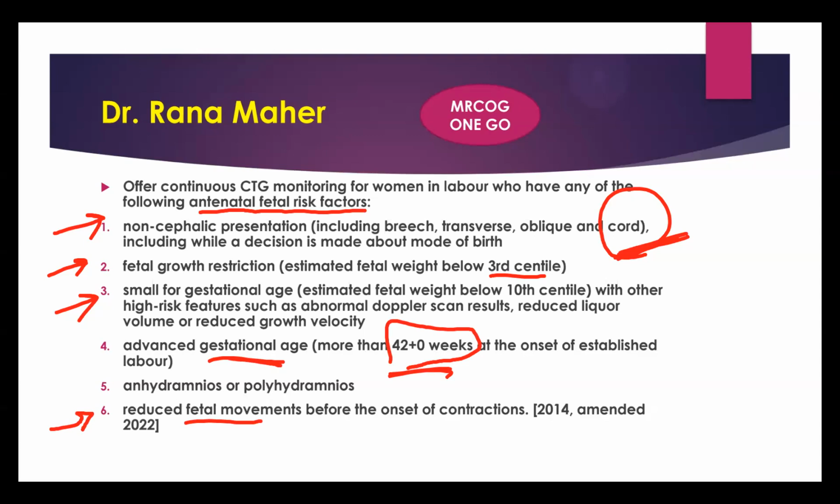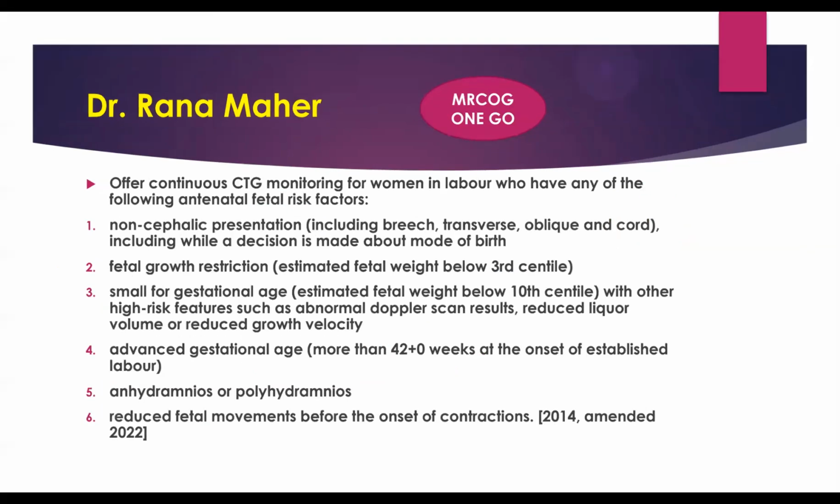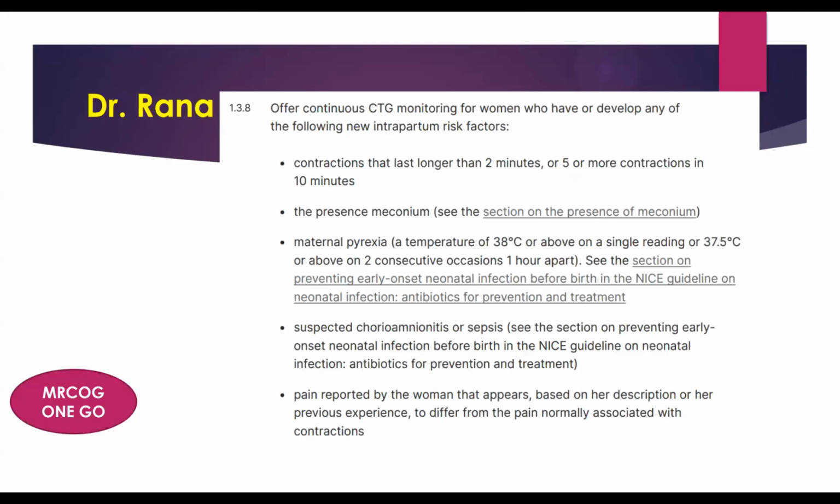For the fetal risk, what about the indications here? Non-cephalic presentation, fetal growth retardation, small for gestational age, prolonged pregnancy more than 42 weeks, and any problem in the amniotic fluid, polyhydramnios, anhydramnios, oligohydramnios, and reduced fetal movement, but it has to be before the onset of the contraction. We will offer continuous CTG.